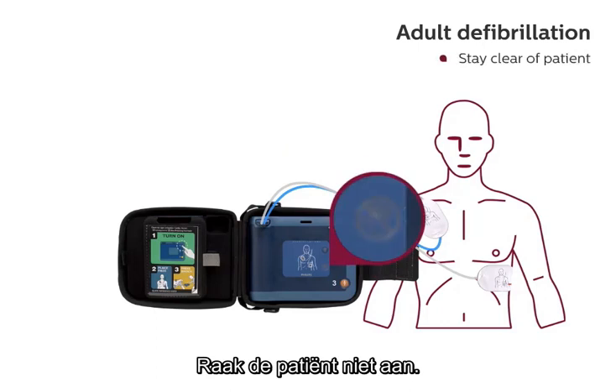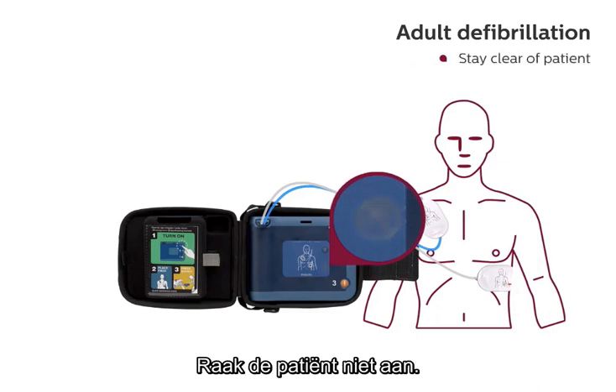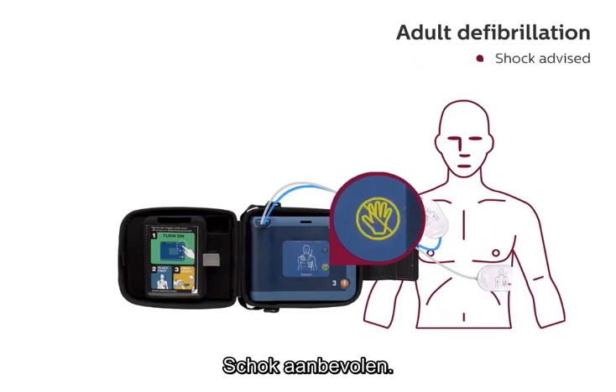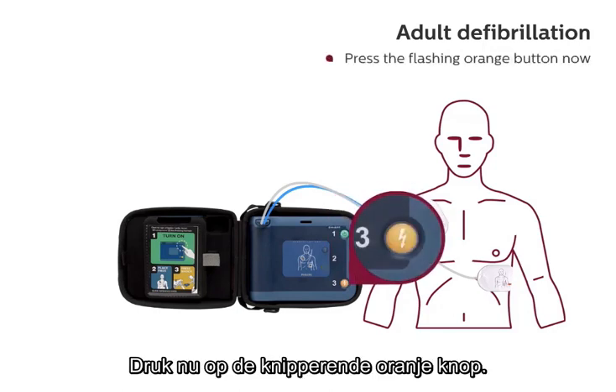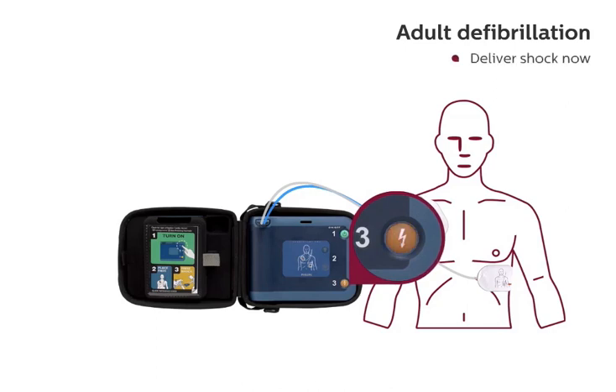Stay clear of patient. Analyzing heart rhythm. Stay clear of patient. Analyzing heart rhythm. Shock advised. Stay clear of patient. Press the flashing orange button now. Deliver shock now. Shock delivered.